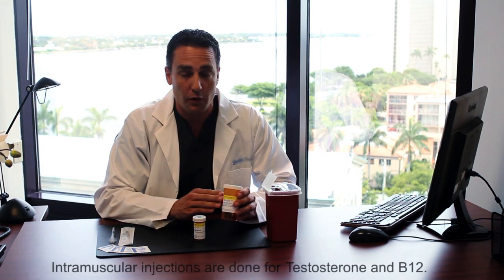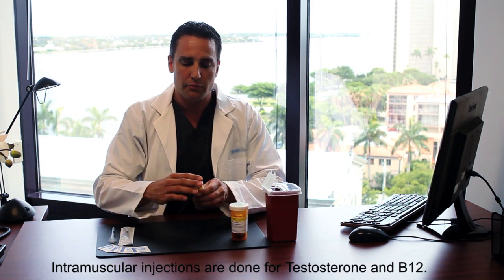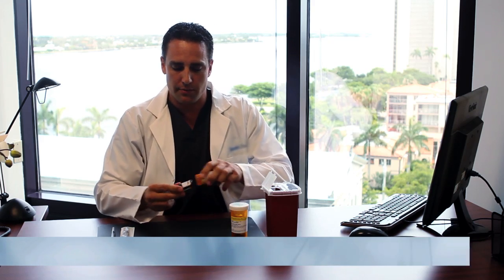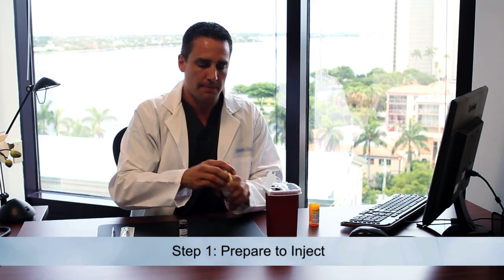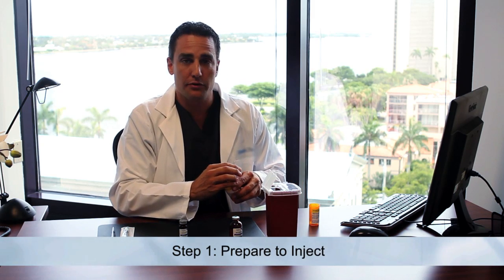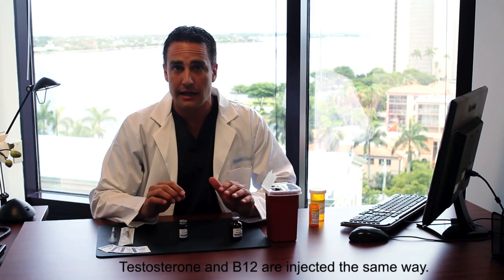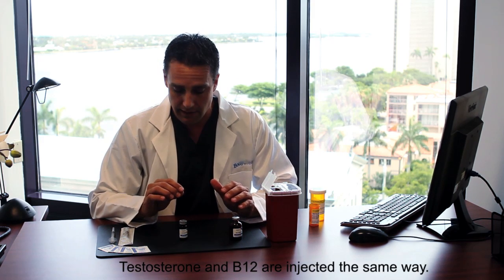For doing your testosterone cypionate and your MIC B12 complex, known as Ultra Slim, this is called an intramuscular injection. So to get ready to prepare for these injections, go ahead and take the medications out of the protective vials. For illustration purposes, we're going to do a testosterone injection. Step by step, protocol by protocol, everything is identical for the injection of both of these medications.